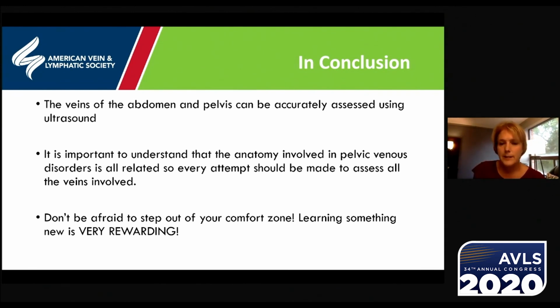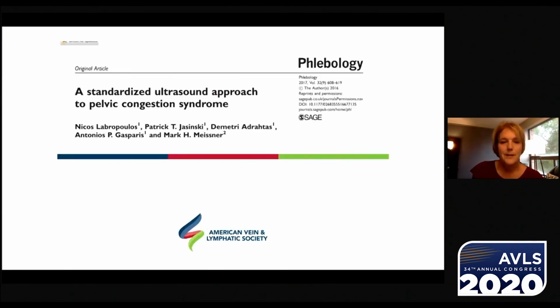And I just want to say, from an ultrasound perspective, as a technologist, don't be afraid to step out of your comfort zone. Learning something new can be very rewarding, and this test seems very daunting, but it actually is quite simple once you get started with it. And again, I just want to acknowledge this paper. Sarah, Mariah, and I have said multiple times that we wish this paper was around when we were learning these studies. It would have made life much easier, so I recommend that you obtain it and keep it in your vascular lab for reference.